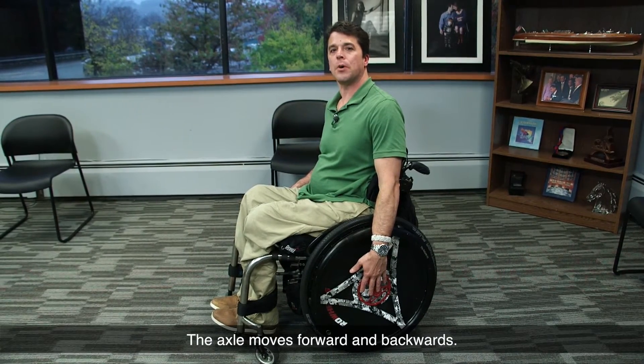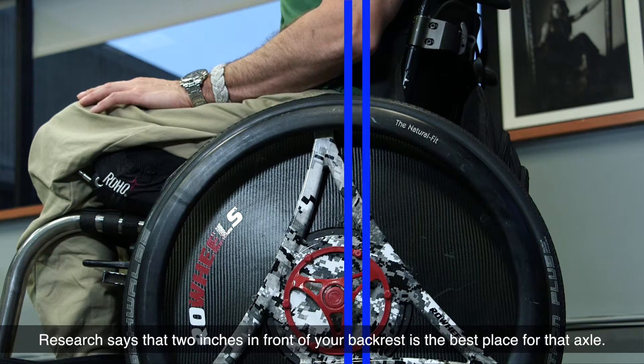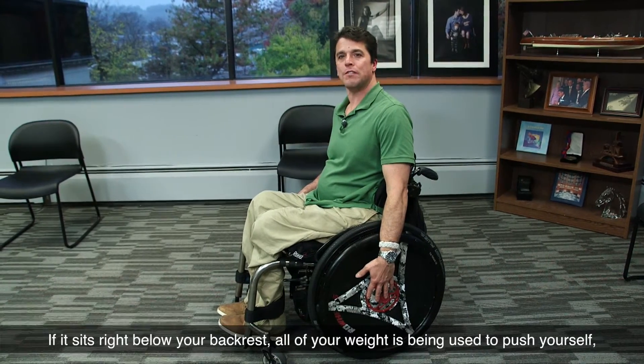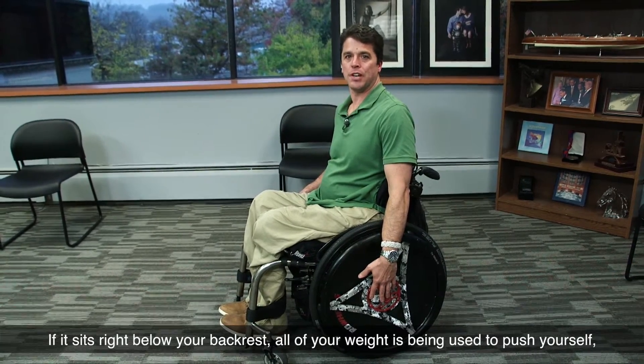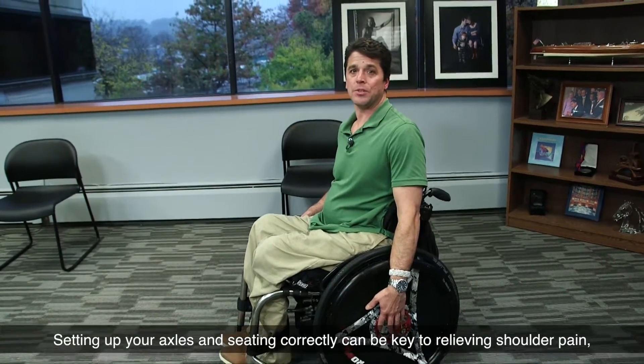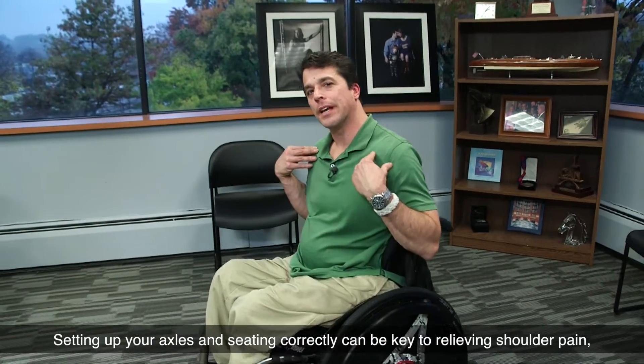The axle moves forward and backwards. Research says that two inches in front of your backrest is the best place for that axle. If it sits right below your backrest, all of your weight is being used to push yourself, and you are thus working too hard to move. Setting up your axles and seating correctly can be key to relieving shoulder pain.